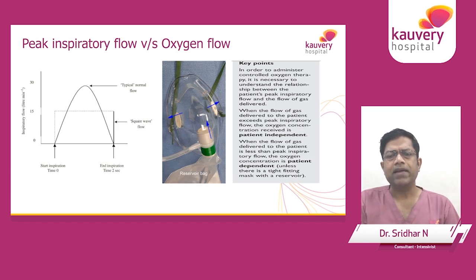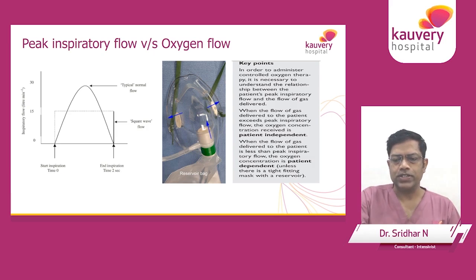This is currently my favorite device to use in patients who are sick and needing more than 50 to 60% oxygen, because the reservoir bag allows me to meet the patient's peak inspiratory flow without setting very high oxygen flows on my oxygen meters or using high flow cannulas. This allows me to conserve oxygen.